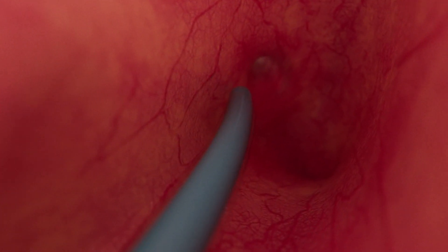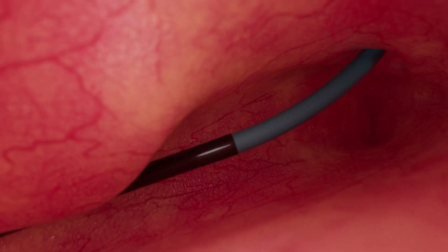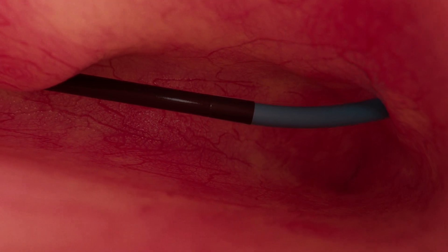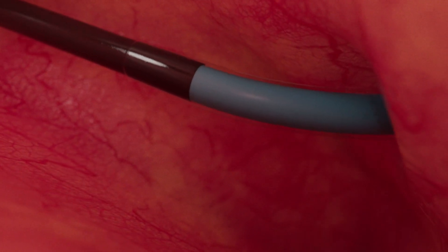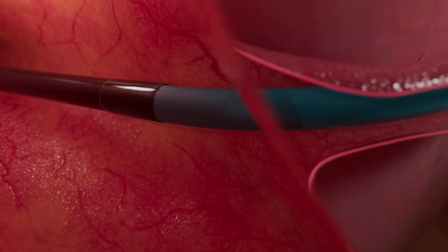Place the ball tip of the Audion device along the superior portion of the opening and enter approximately 10 mm. Next, advance the balloon. Using the atraumatic flexible tip of FlexFeel technology, position the device about 20 mm into the Eustachian tube, stopping when the blue to grey transition is at the opening.